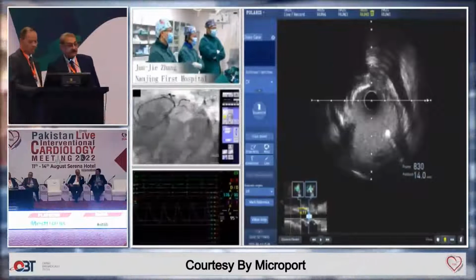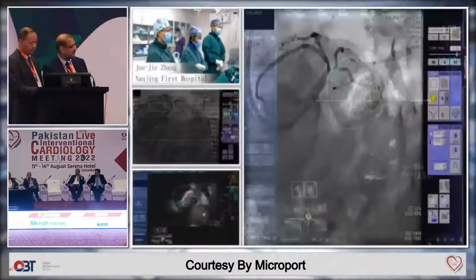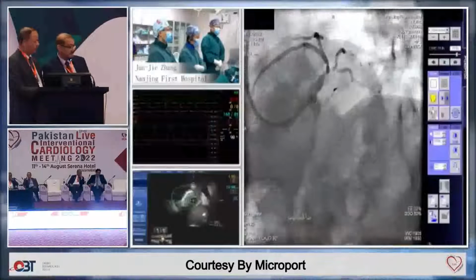Yeah, thank you. We have seen the IVUS findings now. Can we just request quick comments from the experts? What do they think about the strategy?